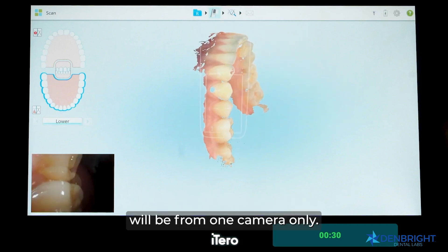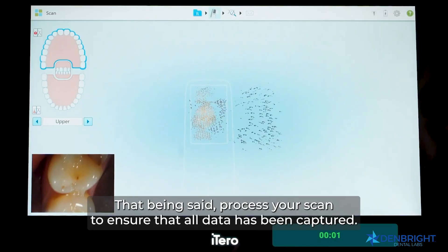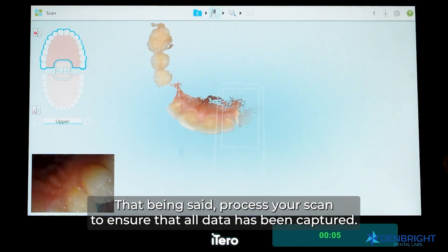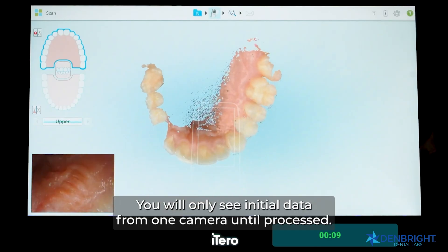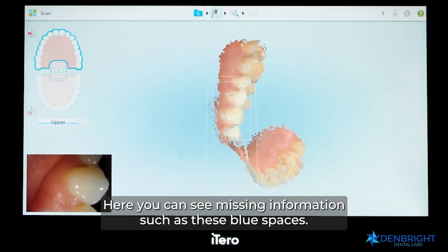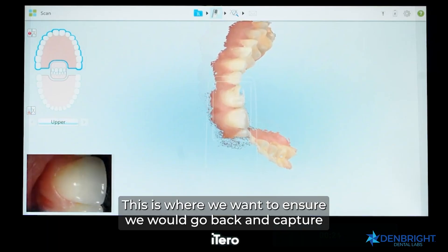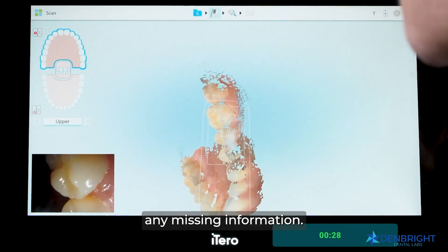Make sure you scan quickly. With the new Lumina, we now have six cameras versus two. The initial scan shown on the screen will be from one camera only. Process your scan to ensure all data has been captured — you will only see initial data from one camera until processed. Once processed, all six cameras' data will be shown. You can see missing information as blue spaces; go back and capture any missing areas.